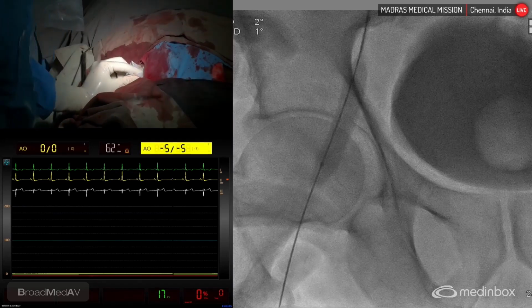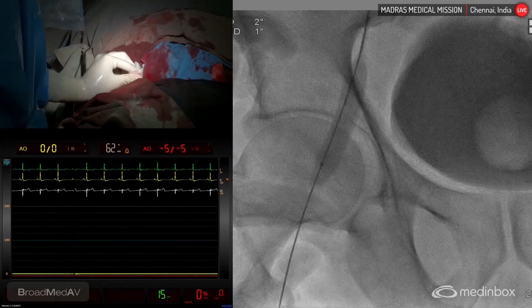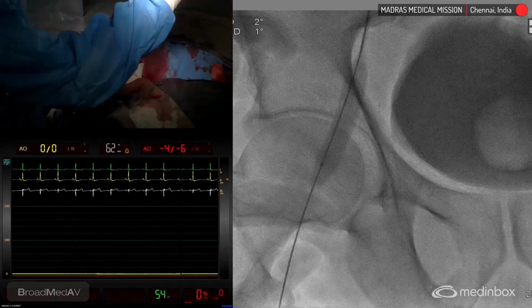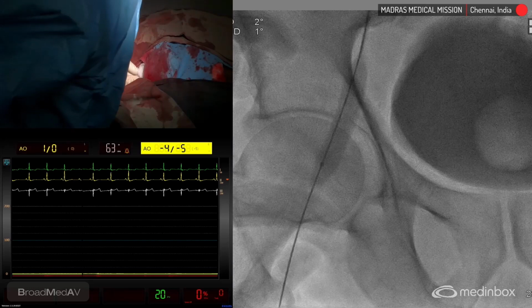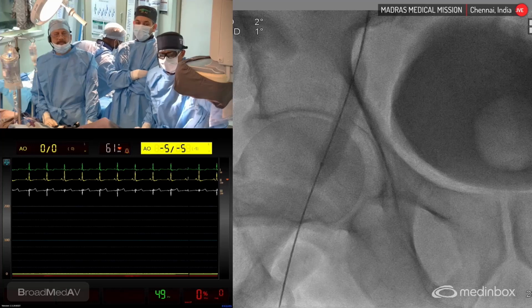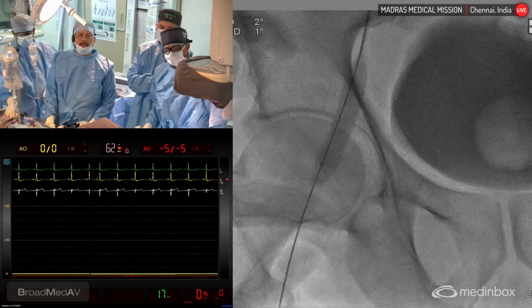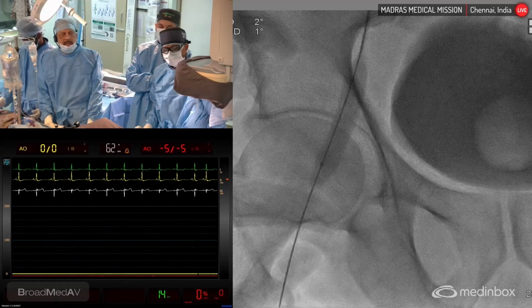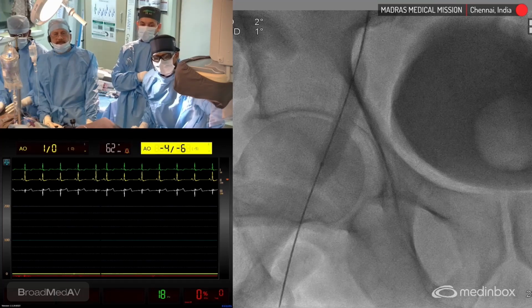Aneurysm with thrombus. Are you able to balloon expand this stent if there is a need? Usually with the Coda balloon we try to approximate the proximal and distal edges. You can do balloon expandable, but one has to be careful that you shouldn't dissect the aorta. Would you consider embolic protection with the Sentinel or similar devices? Yeah, when you are doing landing in zone 0 or 1, where the neck vessels are involved and the patient has thrombus in the arch, then one can consider cerebral protection devices.